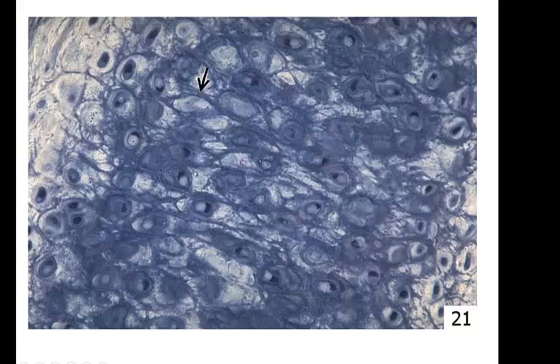And this kind of looks like a peacock tail, doesn't it? Also, the reason it's called elastic cartilage is because these little fibers you see in the background here, and there are little owl eyes right there, these are all elastic fibers.